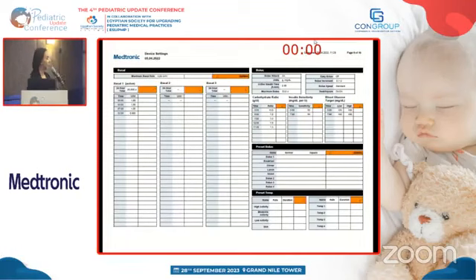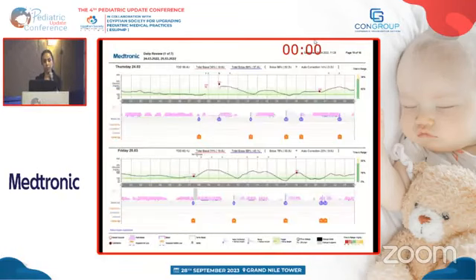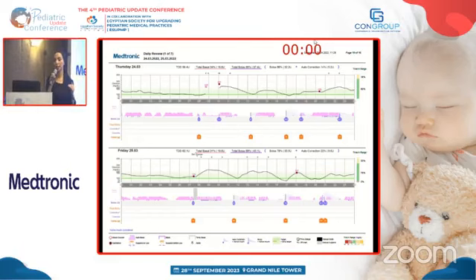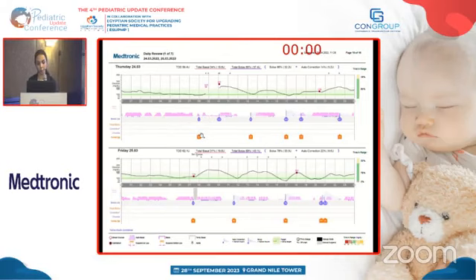أوكي. هنا ده بيوريني المانيوال سيتنجز اللي موجودة على البومب. هنا لو أنا بقى عايزة أبص مع البيشنت بتاعي داي باي داي، همشي في الديلي ريبورت، عايزة أراجع معاه يوم بيوم كامل. فهنا فور اكزامبل أول يوم عشان نشوف الدوز بتاعة الفطار هنلاقي إن هو قبل الفطار كانت الساعة 8 دخل للبومب إن هو هياكل 25 كارب.